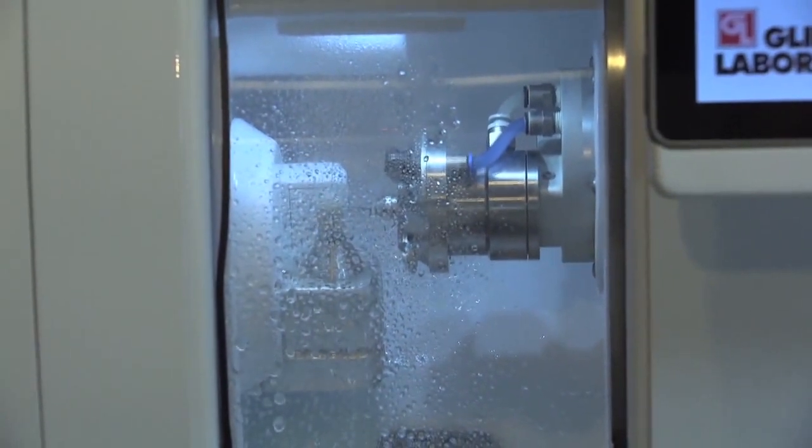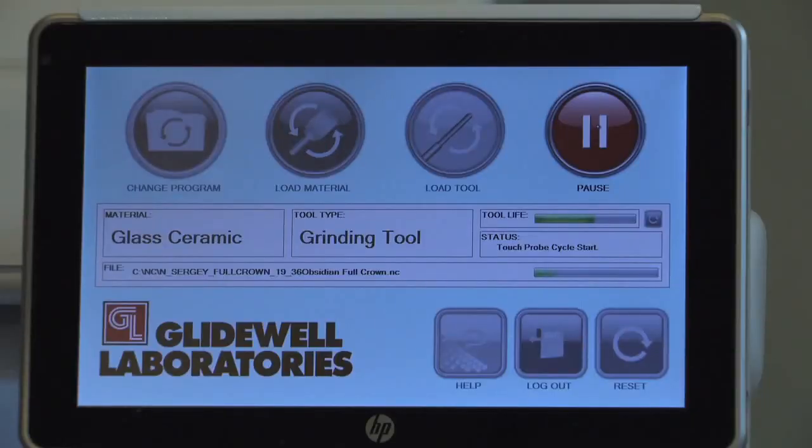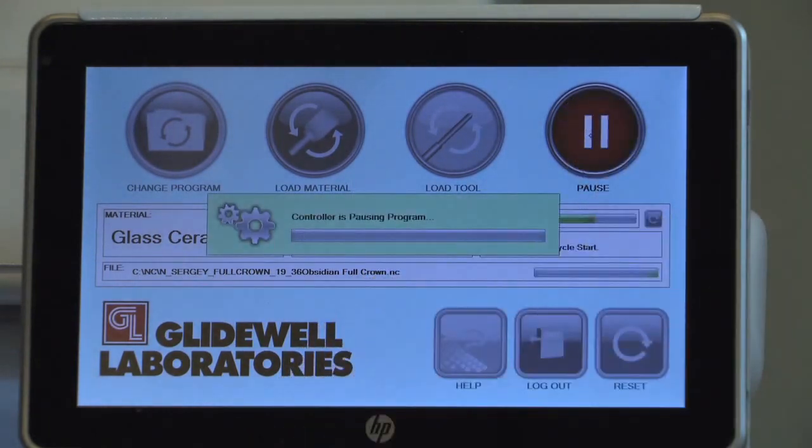The milling process will take several minutes to complete, depending on the size of the restoration. The milling process can be paused and resumed for any reason by pressing the Pause and Resume buttons, respectively.